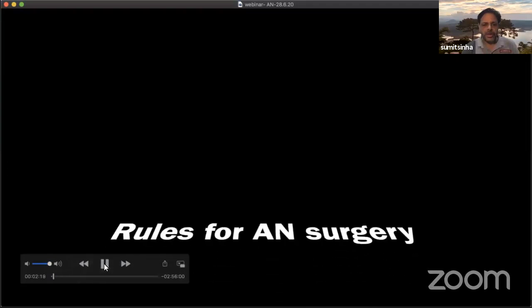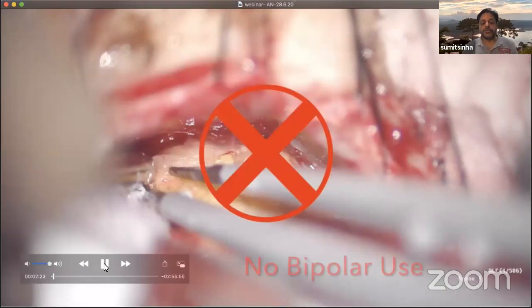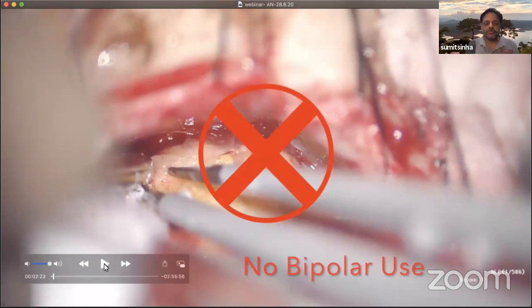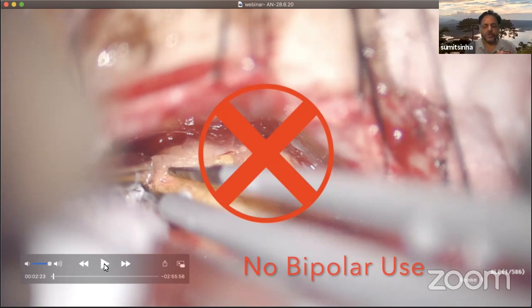So before I start the surgical video, I want to tell you some rules of acoustic neuroma surgery. The first most important rule is, do not use a bipolar anytime during the surgical procedure. Very little. If you have to use your bipolar, then this means that there's something wrong, which is the philosophy of doing this surgery: not to use a bipolar.